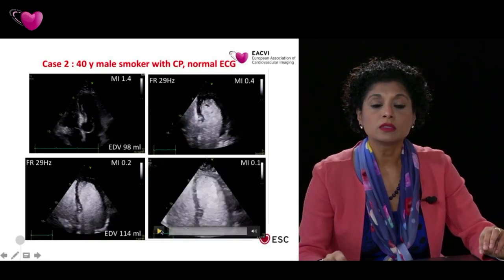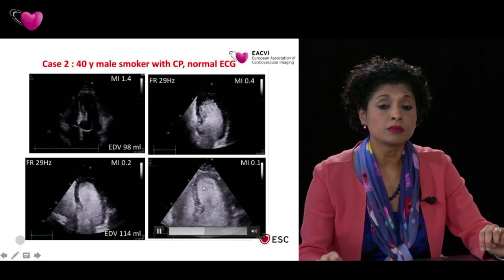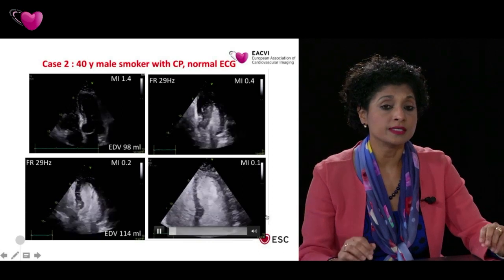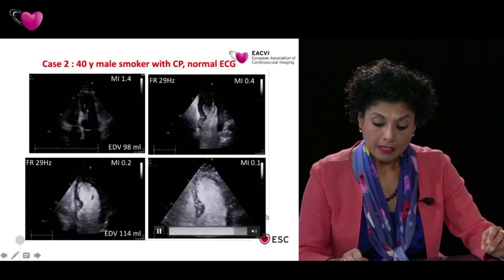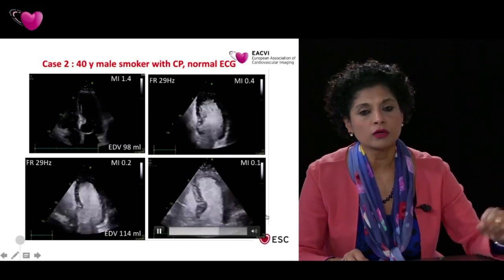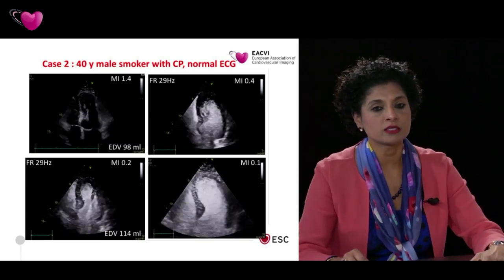By turning down the mechanical index even further, you can see the bubbles entering the myocardium, and this setting is used ideally for perfusion studies with the flash replenishment technique, which my colleague, Dr. Gaibazi, will expand upon later.